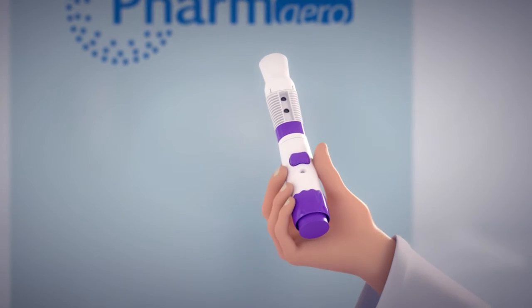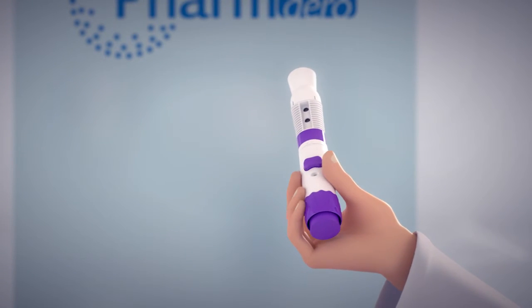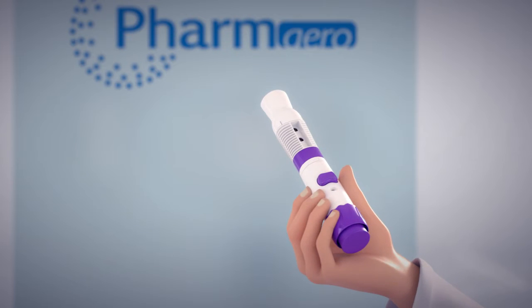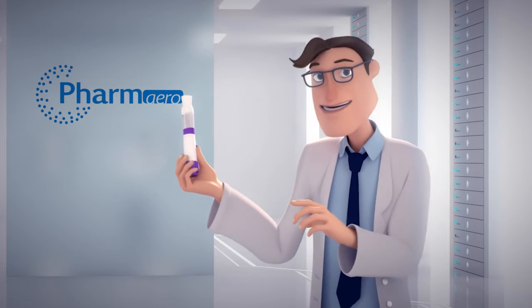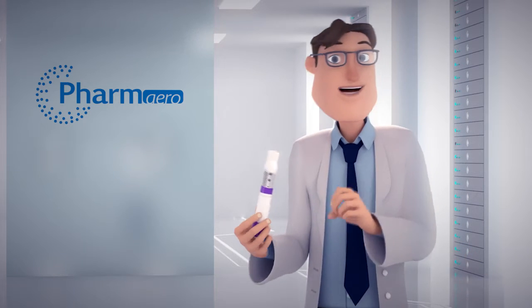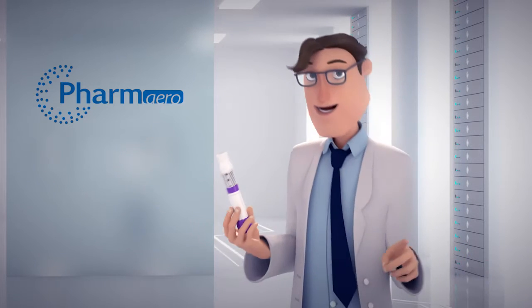This is Pharmaero's new aqueous droplet inhaler. The ADI, as we call it. The ADI is a brand new patented device delivering a soft mist aerosol which can reach any predetermined part of the lungs.